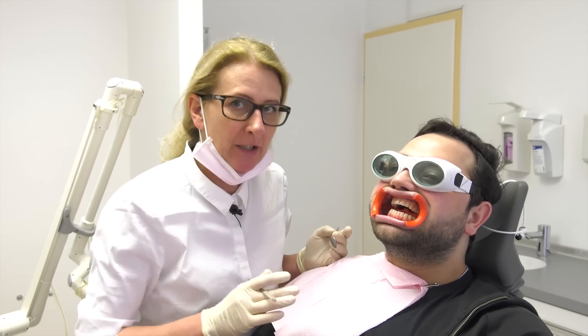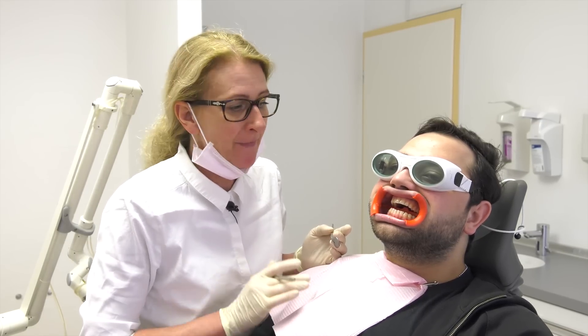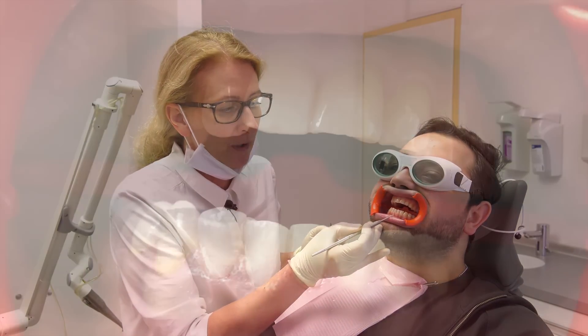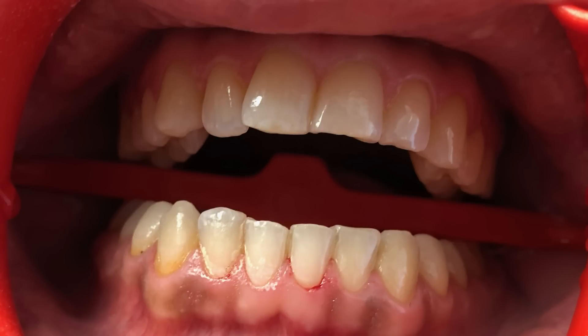Before we go to step number two, just come a bit nearer. I want to show you the surface of the teeth using these two different medical equipments. As you can see, on the right-hand side we used the dental scaler - can you see this kind of bleeding spot? Compared to the treatment using the Erbium YAG laser, there is no bleeding spot.